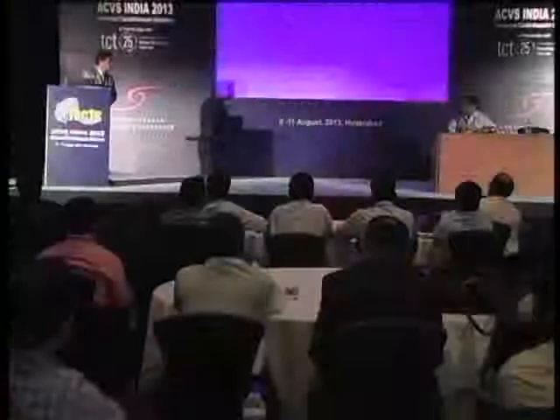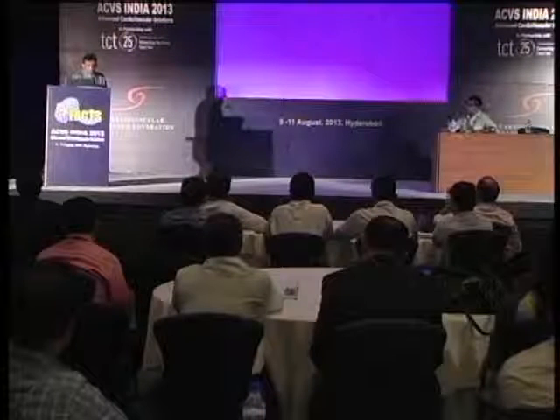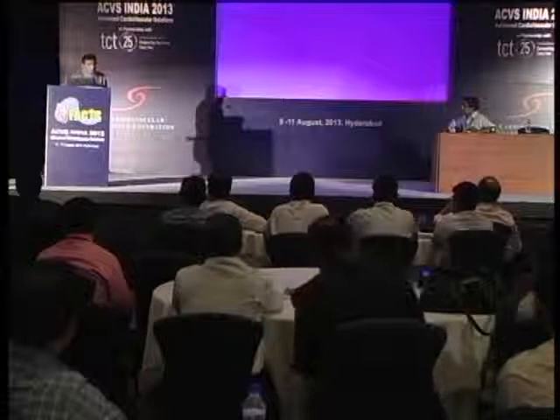Thank you. Thanks for the presentation. We have experience with Silverhawk in the peripheral vessels, but in coronaries, the experience we have is zero. What's the level of evidence and any RCTs of using atherectomy in coronary arteries? I'm totally unaware of this. Are there any randomized controlled trials for this device? No, there are not. Actually, coronary Silverhawk is a totally out-of-the-box indication.